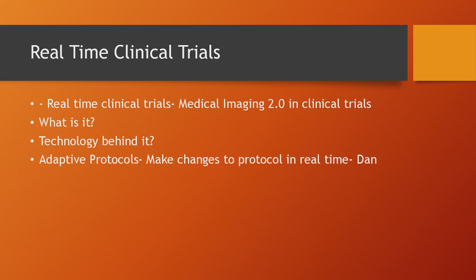The system is working right now in Microsoft Azure, which is our cloud provider. And the algorithms are mainly developed in Python, C++ and MATLAB. So we have a server for the main database for the clinical trial. We have also servers for the computational analysis.